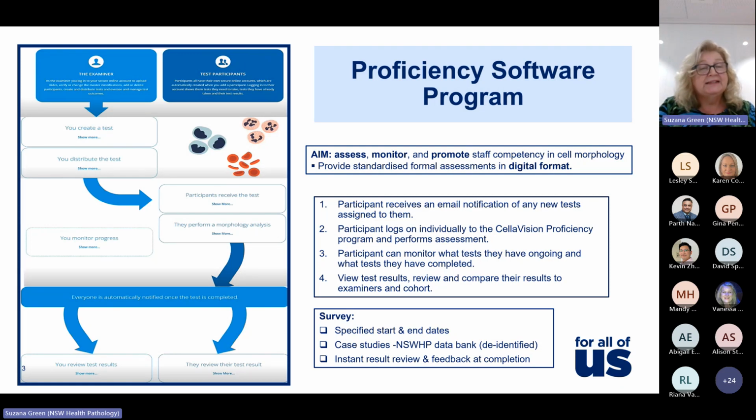So we created the test. They got on, performed the test, submitted it, and then could view the results automatically if we chose, or there were end dates where the results would go out at a specific date. We used case studies from our New South Wales Health Pathology Databank. So they were our patients, but they were all de-identified. And as I said, the participants got that feedback at the conclusion and submission of their tests.